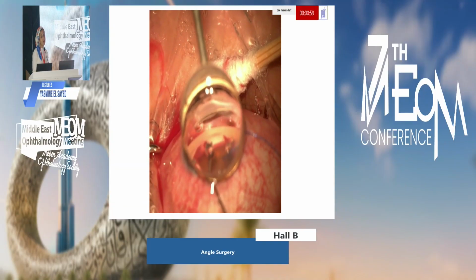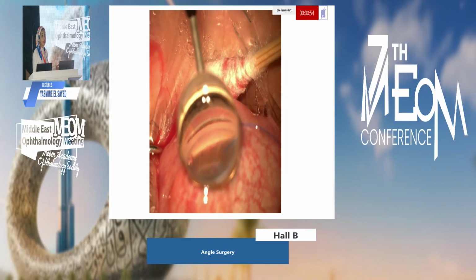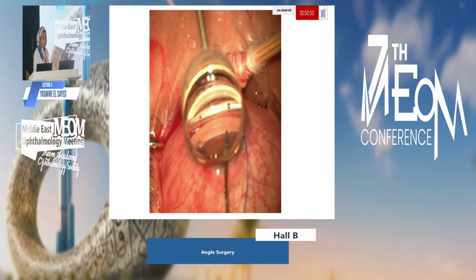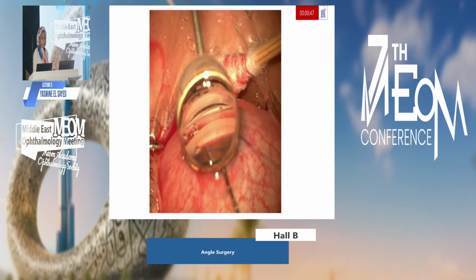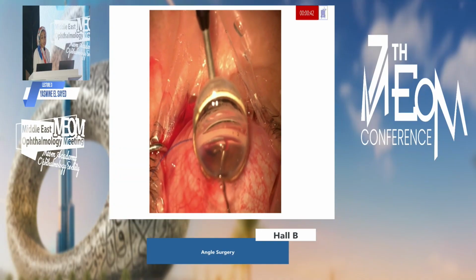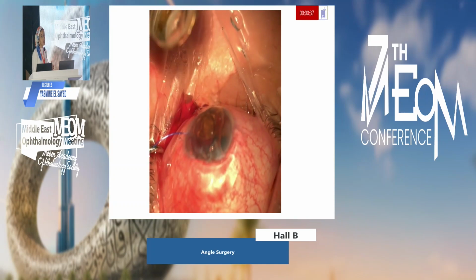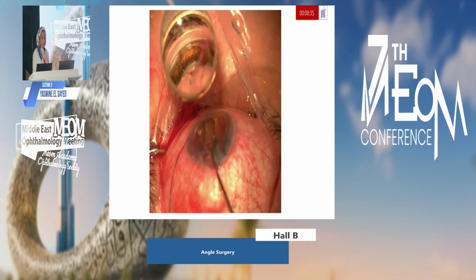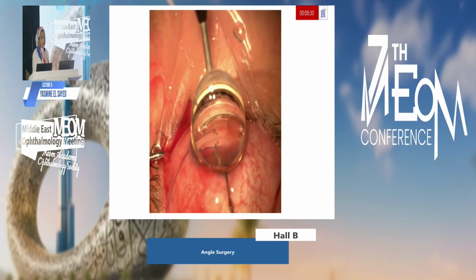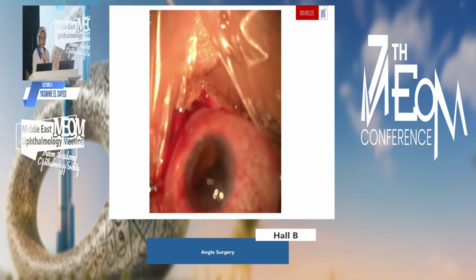I've operated on a lot of patients who had to continue on their anticoagulants and didn't find any bleeding. And then you get a healthy young adult with juvenile open-angle glaucoma, and they bleed horrendously on table, even though the iris is untouched. So we need to use high viscosity viscocohesive, wash the anterior chamber every time. Whenever we feel that things are too cloudy and we can't visualize, we need to stop and wash. And if it goes between the lens and the cornea and hinders visualization, then it's okay to just stop, wash everything, and make a new clean start.